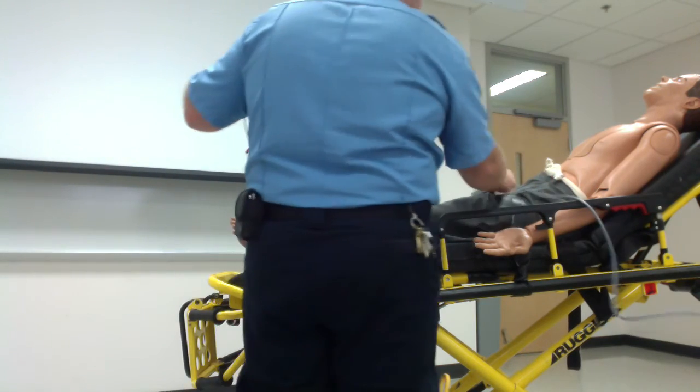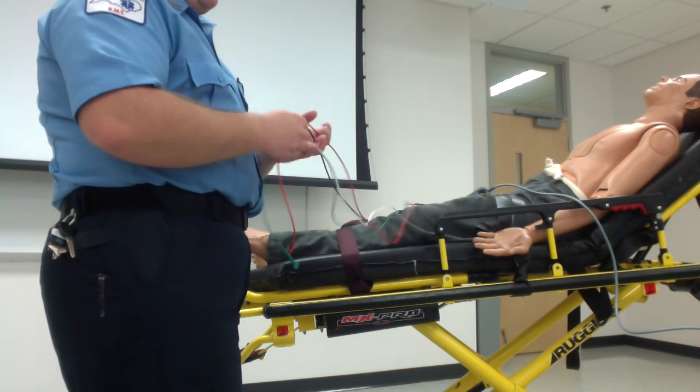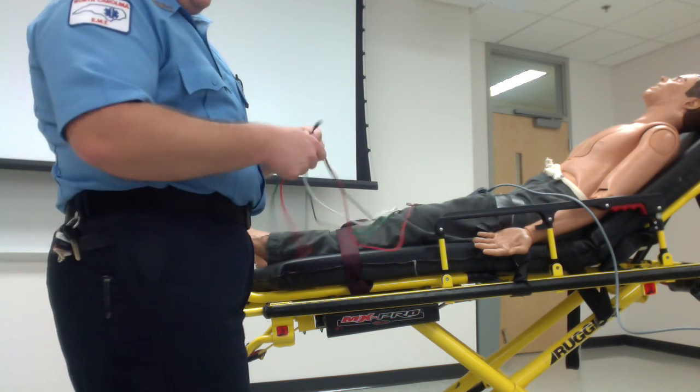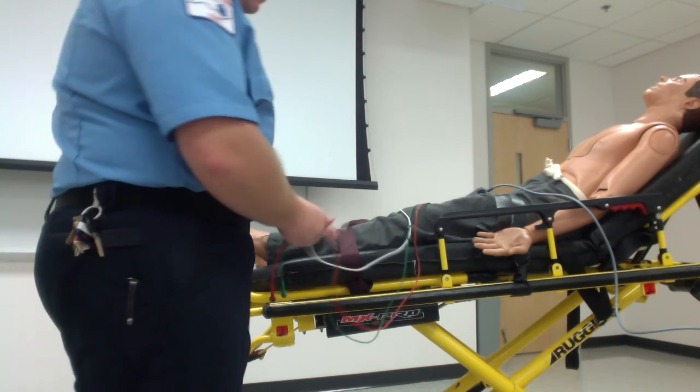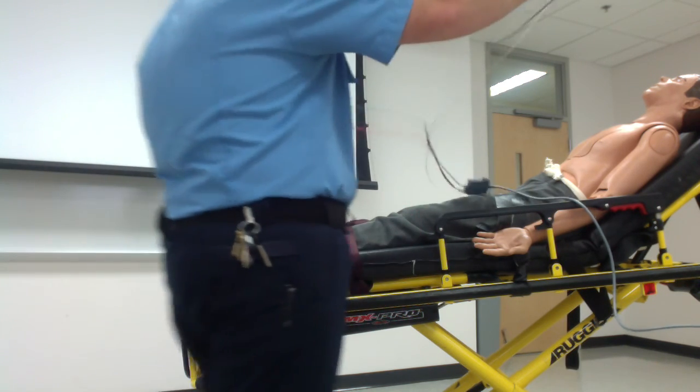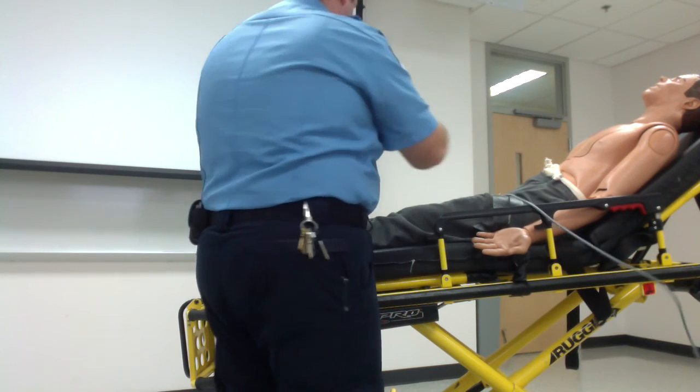So you'll pull them out. I try to run my fingers up and split my wires up some. That way I know, okay, these wires are going to go here. I've got my arm wires in one hand and leg wires in my other hand. That way I can work through it a little bit easier and keep things a little bit neater on the patient.